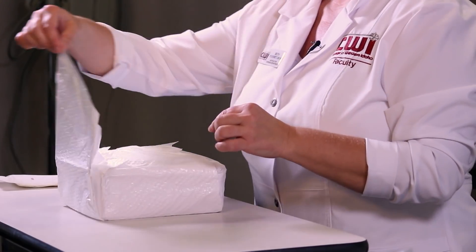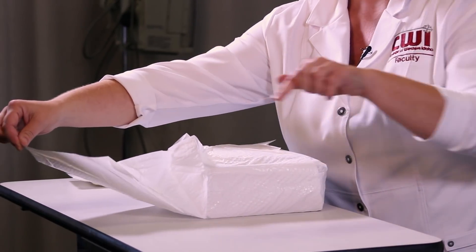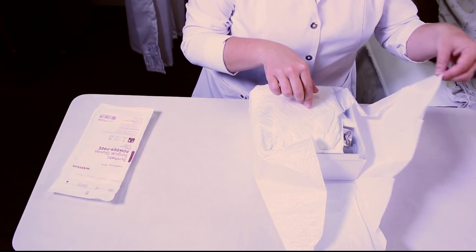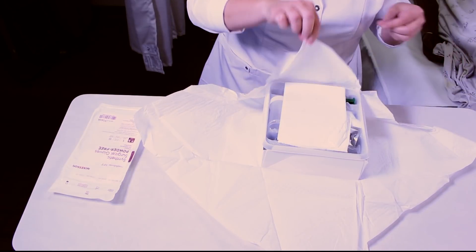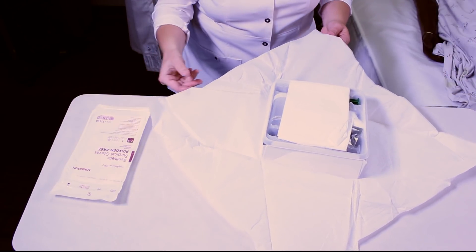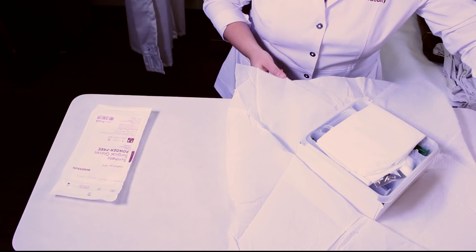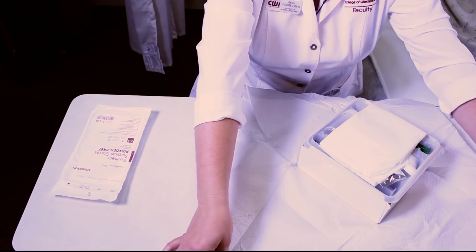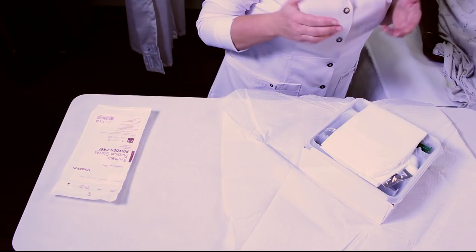We'll start by taking the end that's away from you, keeping in mind that the one-inch portion around the edge of the drape is not sterile. You always want to do the edge that's away from you first. You never want to reach completely over your sterile field.